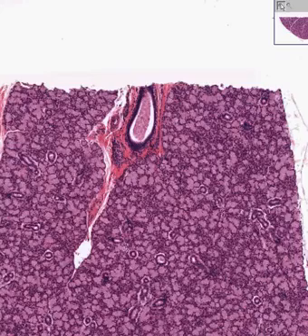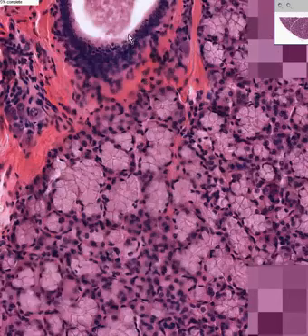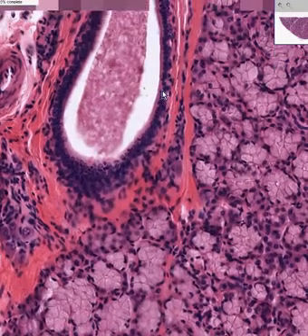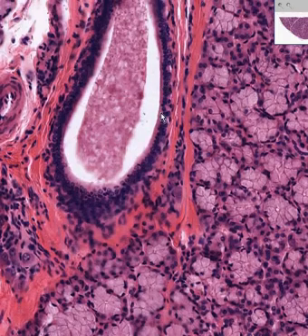It looks like it's columnar. It looks like it's non-ciliated. It looks like it's non-stratified. So, like most of the ducts of the exocrine glands in general, it is a simple columnar epithelium. And up here we actually have a little bit of secretion, don't we? Some of the mucin that these acini were pouring out.